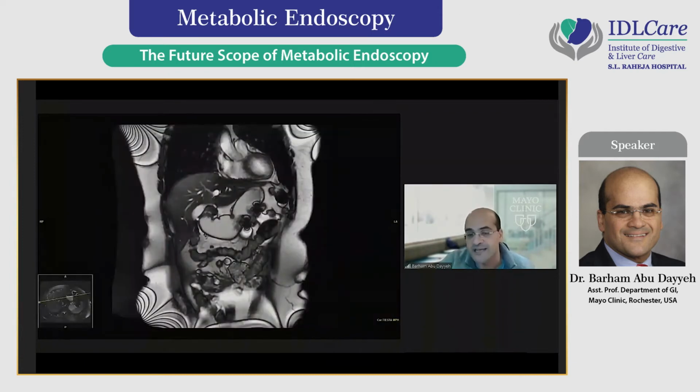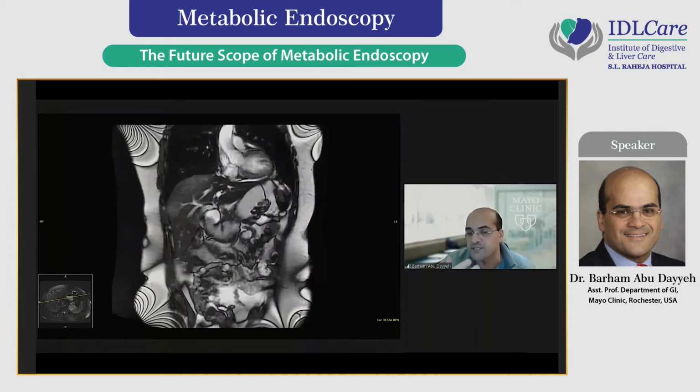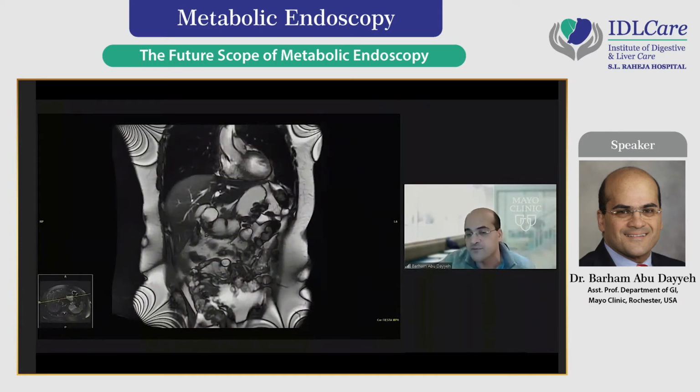It's a procedure that preserves the anatomy and does not create a high pressure system, as you could see with this MRI that we do on these patients. You imbricate the greater curvature by tubularizing and shortening the stomach, but the function of the stomach is preserved. The innervation of the stomach is preserved.